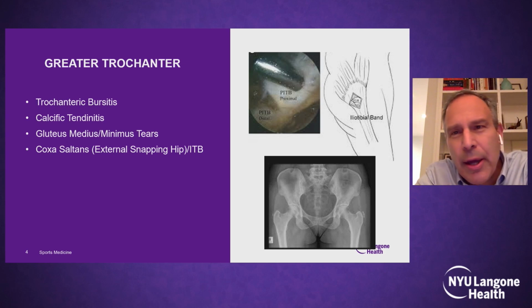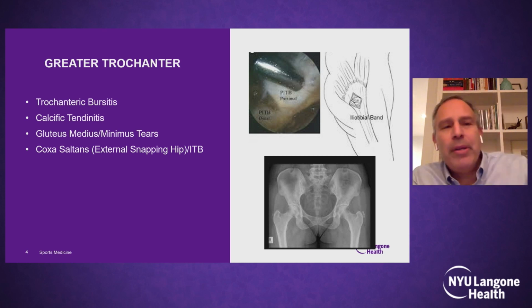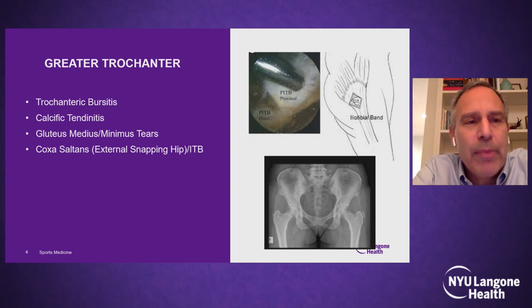One additional area that I have treated is heterotopic ossification, or HO, which typically happens iatrogenically following our procedures. One could argue whether closing the capsule may or may not affect postoperative HO, and we can get into a discussion afterwards about what we all do to prevent or minimize HO from forming. But HO tends to be somewhat extra-articular, and in its lower phases, when it's not specifically bridging, it can be very effectively treated arthroscopically.